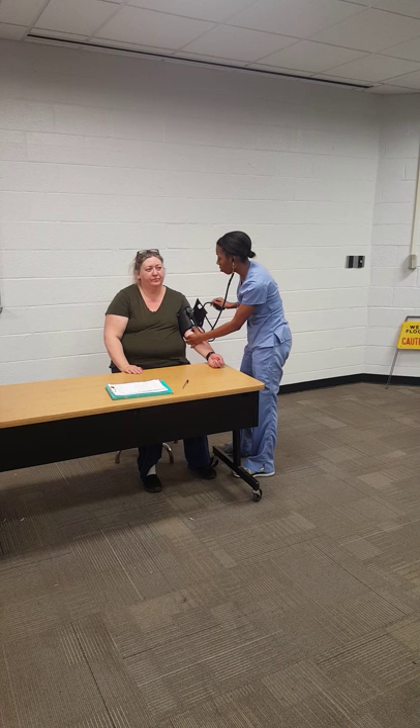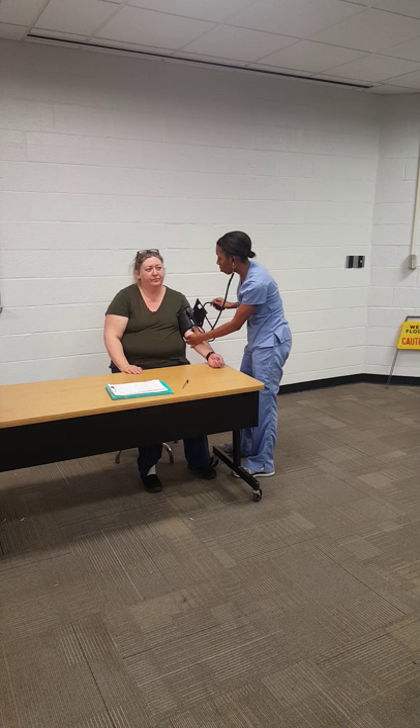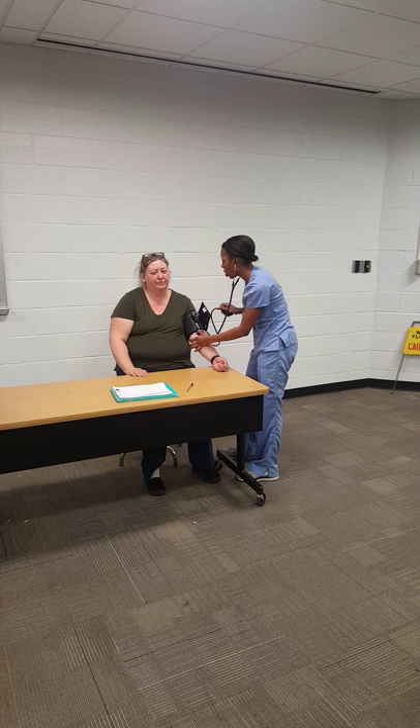The heartbeat starts at about 150. Then you're going to listen for when it stops, and record that number, which is about 98. That gives you a reading that is borderline high, but still not something to be too worried about.